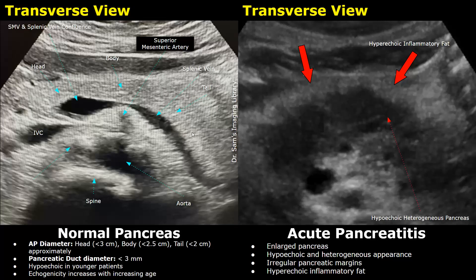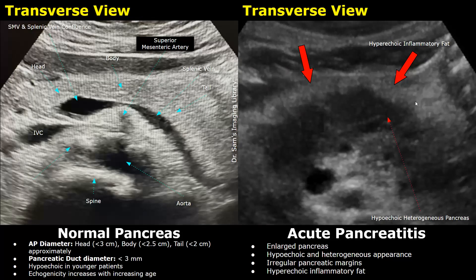The size of the gland is normal. In the image on the right, the pancreas is enlarged and has irregular margins. Irregular margins can be seen in cases of acute pancreatitis. You can also notice the hyperechoic inflammatory fat surrounding the inflamed pancreas.